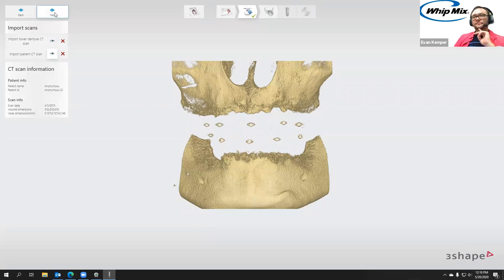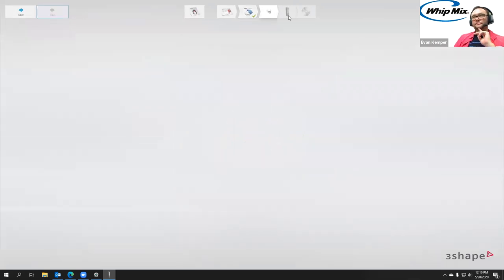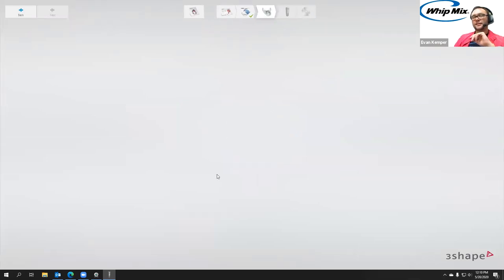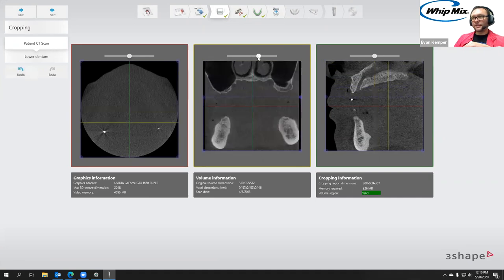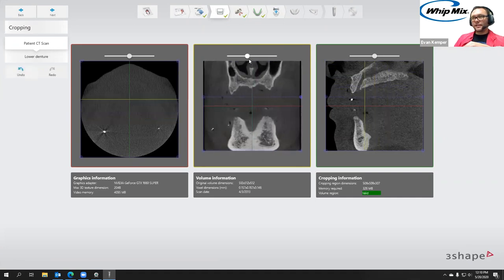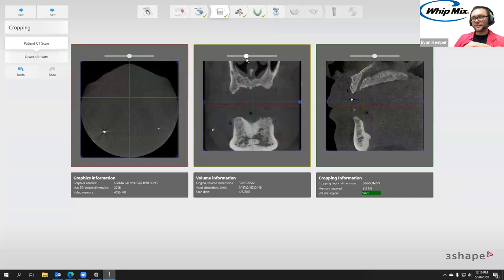We're going to go next into the scan preparation stage, where we're going to trim down these cone beams. First we're doing the head — this works the same way as Monday. I can just drag these blue sliders to crop out what I don't need. Since we're not doing the upper, the key is to make sure we don't trim out any of those lower indicators.